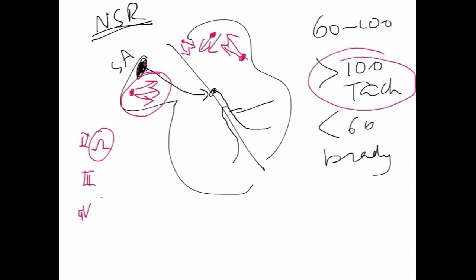Because these are the inferior leads, and anything going inferior should be positive. So let's say this focus was going up. So it's going up, so it's going to be negative in 2, 3, and AVF. Because it's going up, it's going against what it's supposed to be.